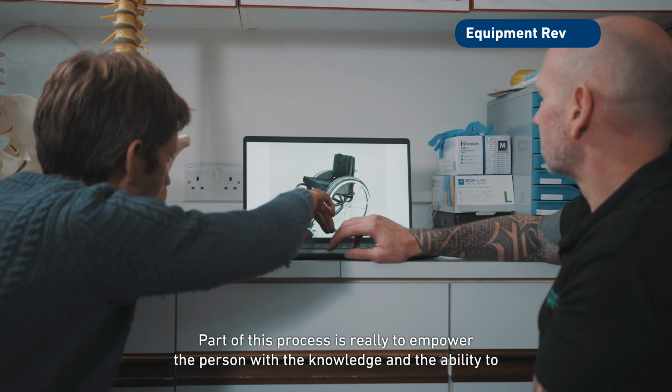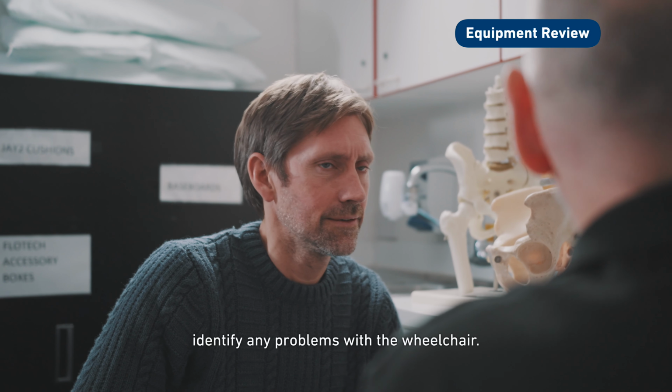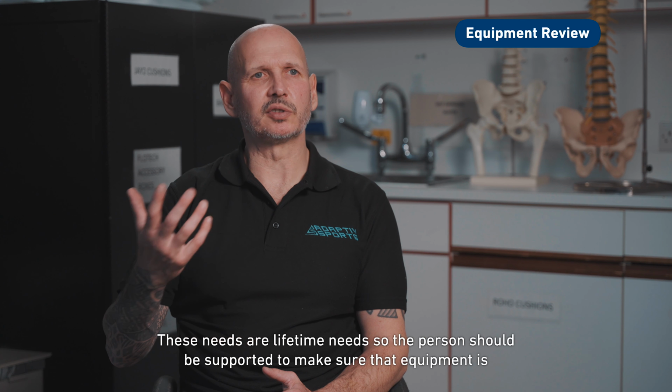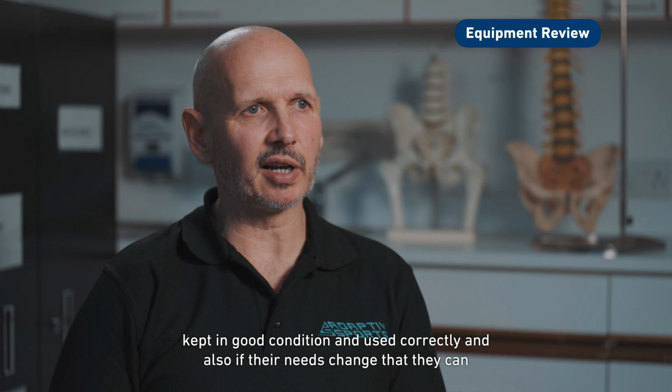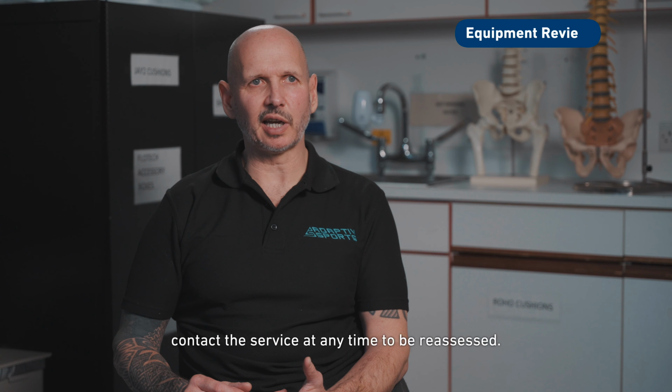Part of this process is really to empower the person with the knowledge and the ability to identify any problems with the wheelchair. These needs are lifetime needs, so the person should be supported to make sure that equipment is kept in good condition and used correctly, and also if their needs change, that they can contact the service at any time to be reassessed.